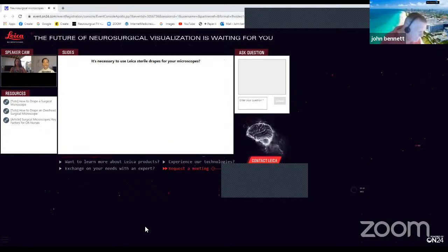Perfect. Sounds good. Our next question coming up is, if during surgery the opposite assistant complains his image is not in focus, is there any way to provide him a sharp image? Yes, there is.